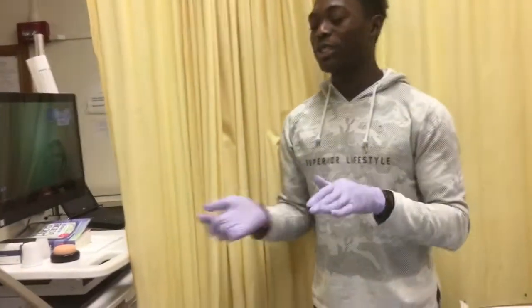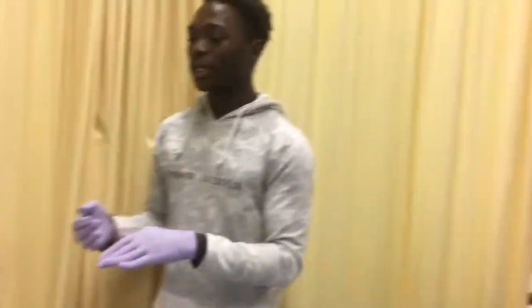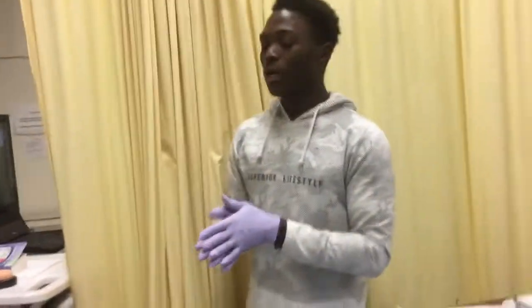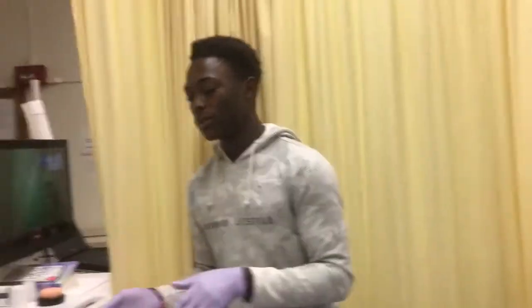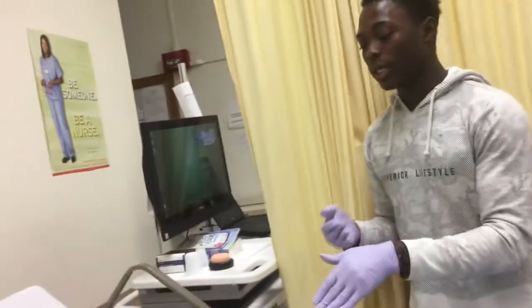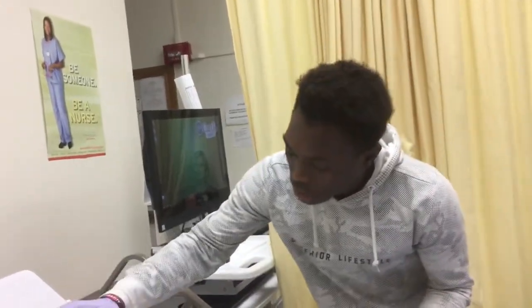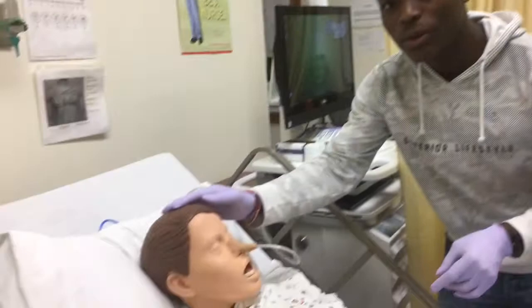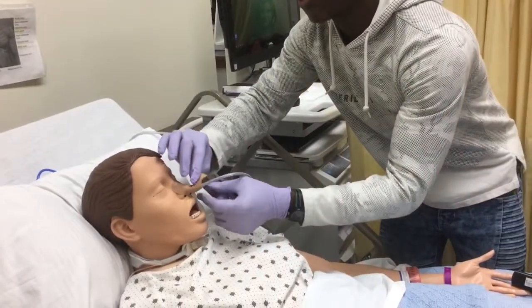So now I'm going to talk about removing an NG tube. If you want to do the procedure, you can come back into the patient room and introduce yourself to the patient and do the same standard procedure: wash your hands, wear your gloves, and tell the patient what you're going to be doing. And once you're done with that, you can ask the patient to take a nice deep breath for you and hold it. And before you do that, you've got to remove this from on there.